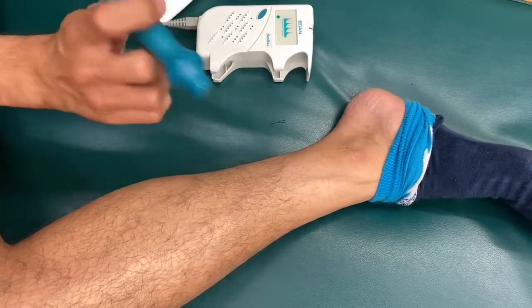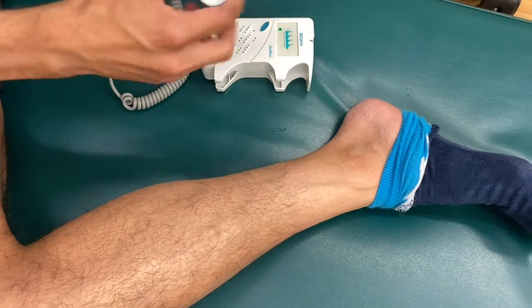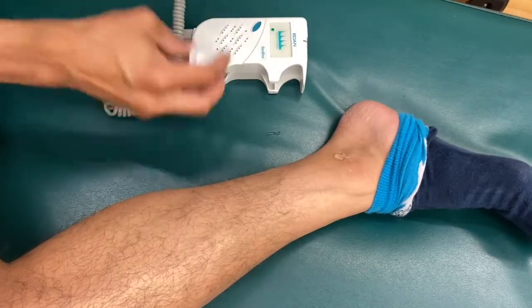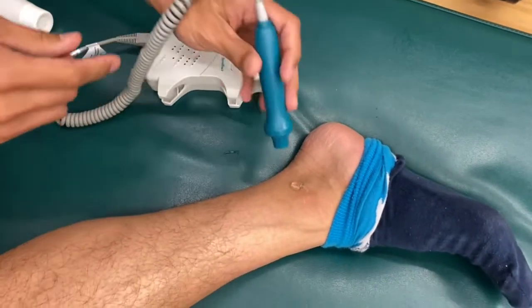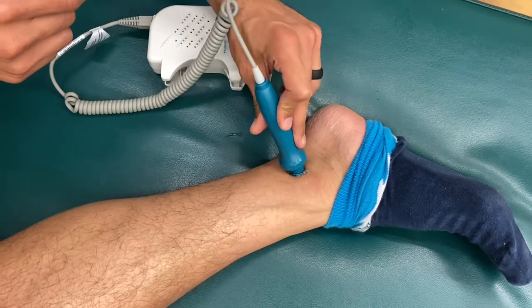Now we're going to take the probe and find, first, what would be really helpful is if we took a little ultrasound gel, allowing us to get a good signal. You don't need too much, just a little dab there, because we kind of already have an idea of where we're going to need to go. And we want to very firmly, don't be too gentle with this, listen for the best signal that we can get.